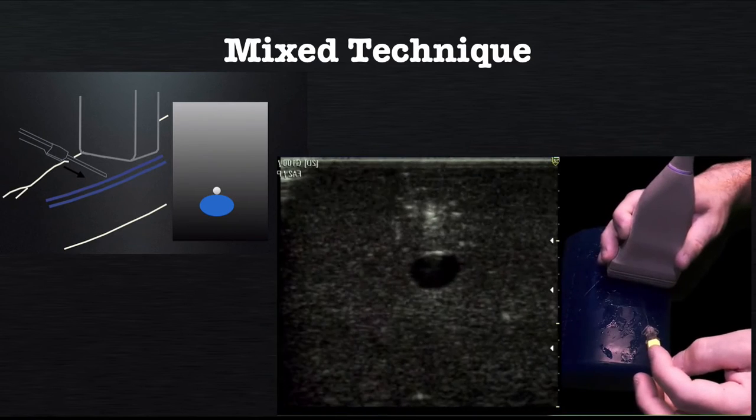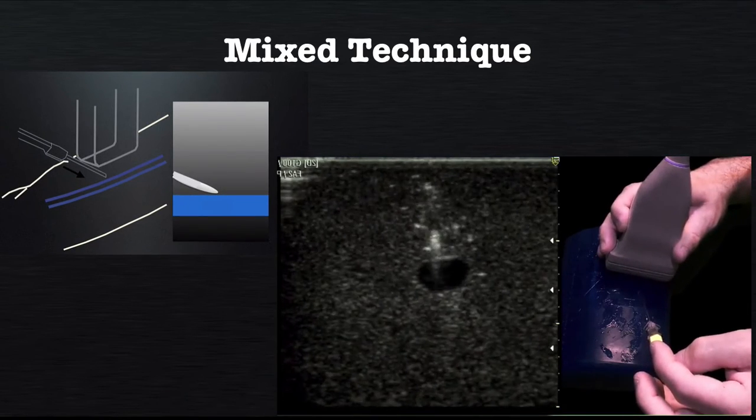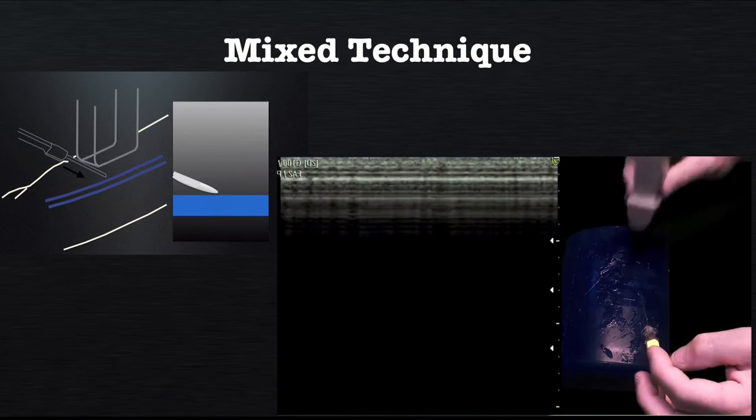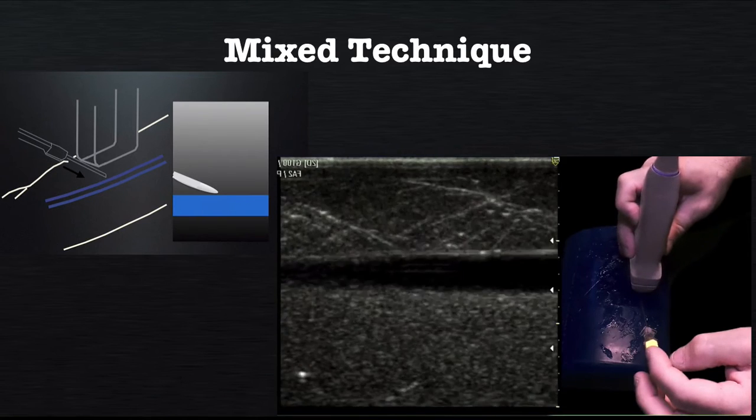When the needle is just above the vein, we can turn to the long axis or in-plane approach. Since the needle is localizing the vein, we know that we are looking at the vein in long axis when we see the needle just above the vessel.